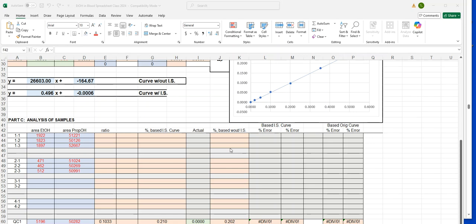All right, guys, in this video, we're going to continue on with the spreadsheet analysis that this lab requires. I know it's not pretty and it's not fun, and we've not done this. This is the most work we've ever done for any lab. At least that's what it sounds like and feels like and smells like and looks like.